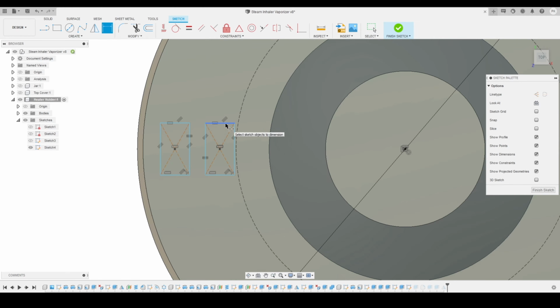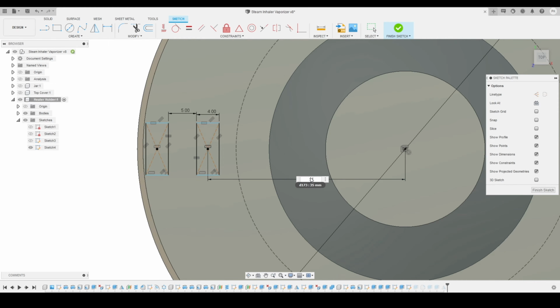And now I will define the measurements of this rectangle. So this is, I think, 3 millimeter wide, and not 3, that is very less. I think we have to keep it 4, and we'll also make sure that they are 5 millimeter apart from each other. So I will just give the distance of 5 millimeter, and now I will try to drag it a little bit towards the left, and then I will define the distance from the main center. So this is, I think, not 35. Maybe 34 will work, or maybe 33 will be fine.